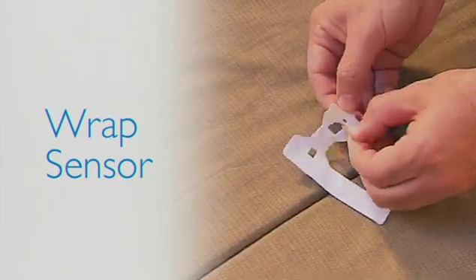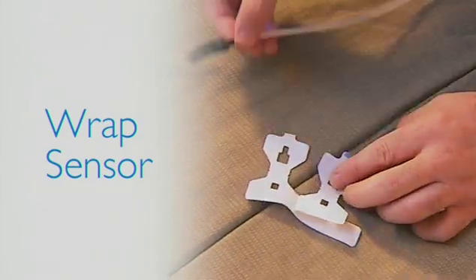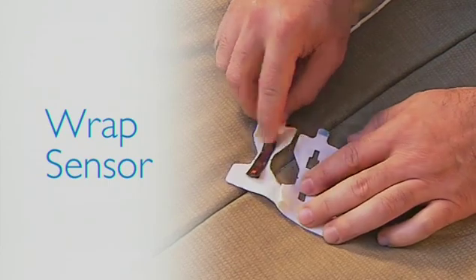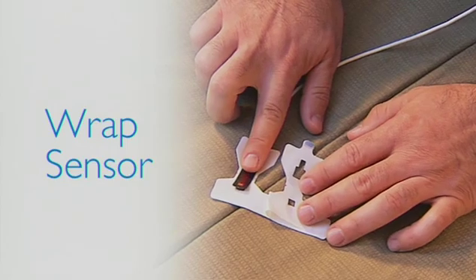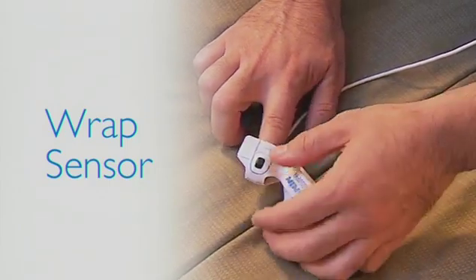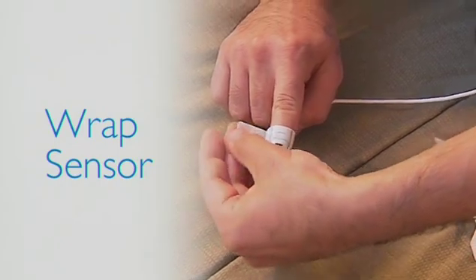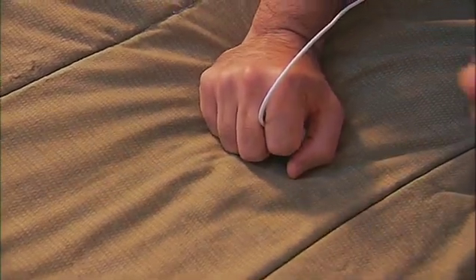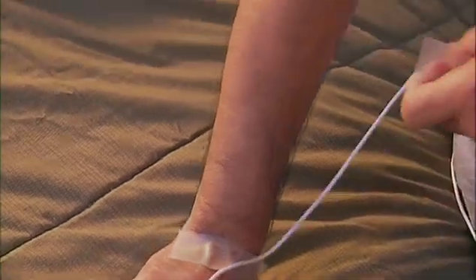If you have a wrap-style sensor, grasp the blue tab on the tape and peel back the paper just enough to expose the cutout portions. Position the black sensor into the cutout section on the adhesive side and press the back side of the sensor firmly into the tape. Place the tip of your index finger over the lower portion of the sensor, then fold the upper portion of the adhesive material over your finger. Refer to the drawing to make sure your finger is properly positioned. Remove the rest of the adhesive backing and fold the wings of the tape over the side of your finger, then wrap the rest of the tape around your finger.